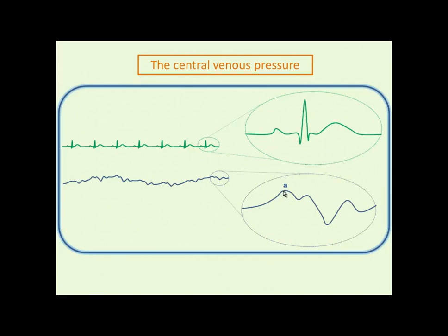And the height of this pressure wave is dependent upon the strength of contraction, the volume transferred, the compliance of the atrium at the time, which is volume dependent. So at very high atrial volumes, actually, compliance is low, so for a given volume, pressures will be higher, and that can become important in patients who are overloaded. Often you'll see these waveforms most pronounced in patients who are wildly fluid overloaded, and if you picture their atria just massively distended, poorly compliant because of the massive distension, then that poor compliance is going to make the pressure changes even more pronounced, so you'll often see all these waveforms in overloaded patients.